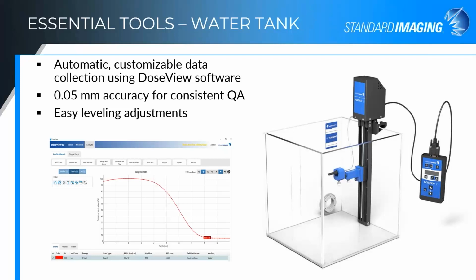Every year when you pull it out for annuals, or if you have to pull it out for commissioning, even though it's easy to relearn and renavigate, if you're using it more on a monthly basis, it's completely familiar to you when you get to time for annuals or for commissioning.